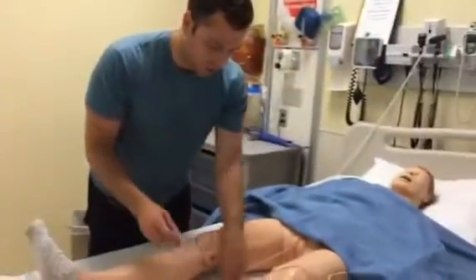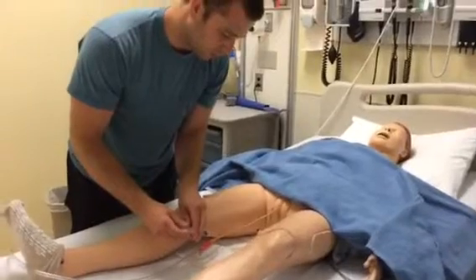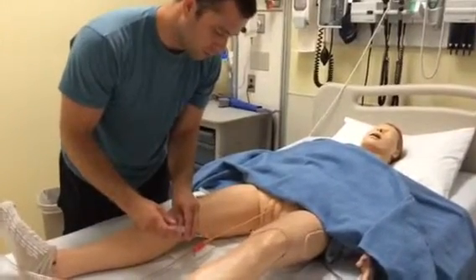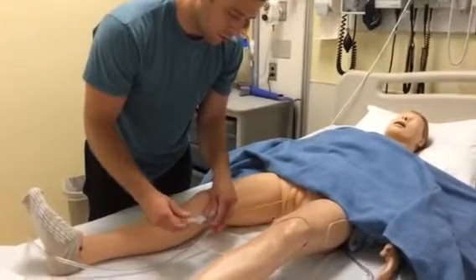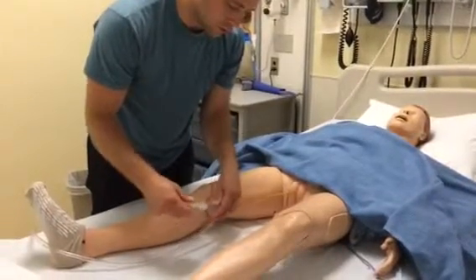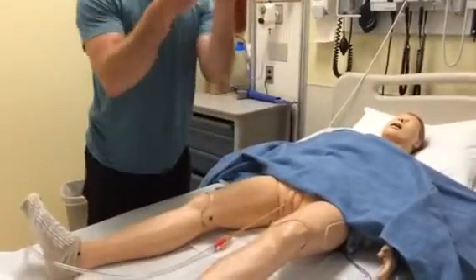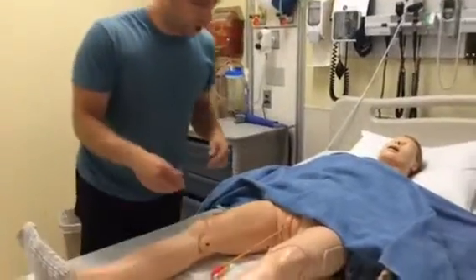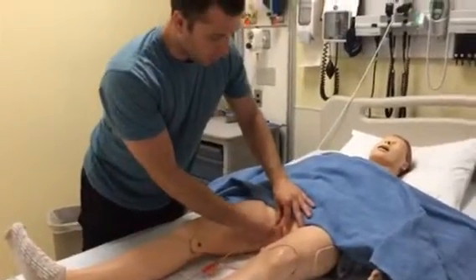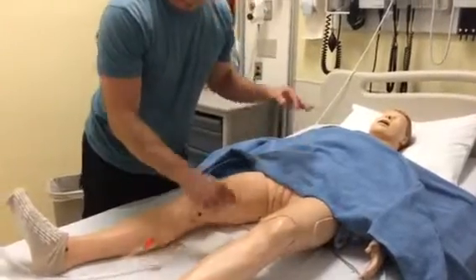Use this syringe to remove the 10 milliliters of water. And just remove that, just check to be sure that all 10 milliliters came out. And we're good. And so I'll have you bear down, and we're going to pull, and we are good.